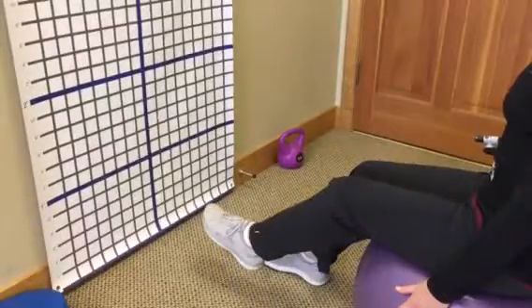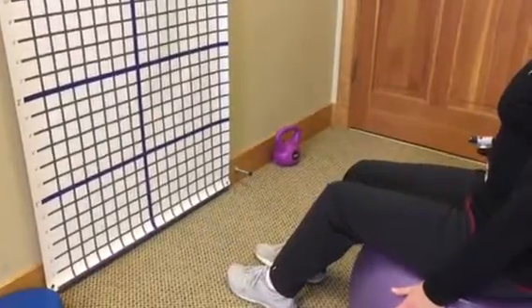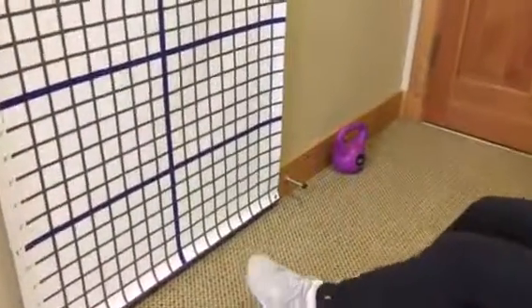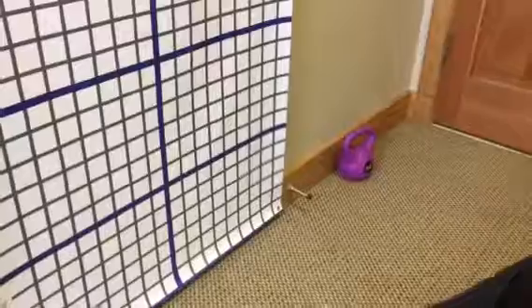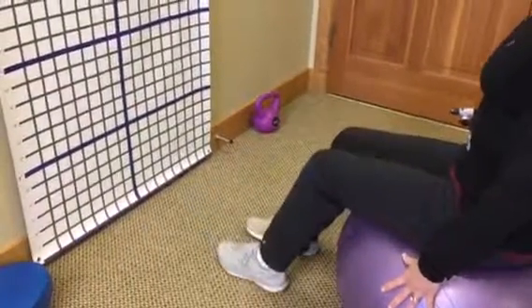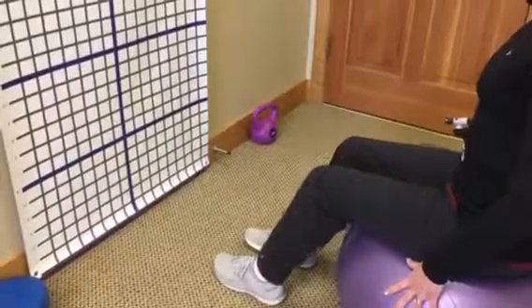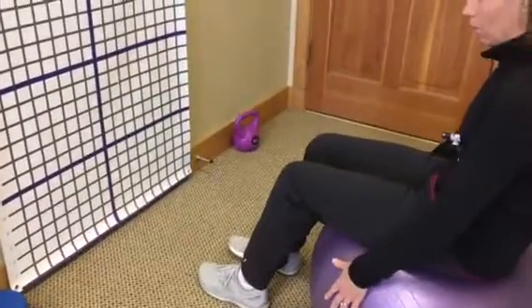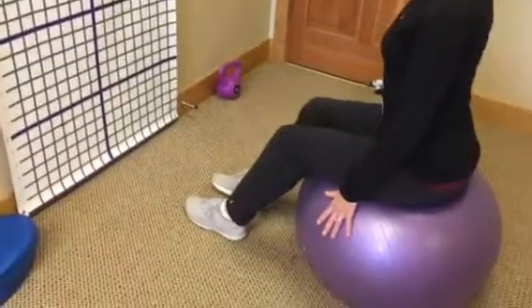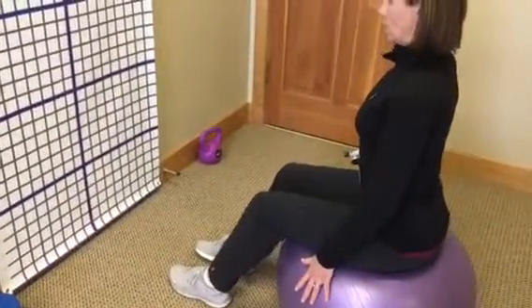Now if I didn't have good stabilization in my core, what might happen is I would start to lose my form and then the patient would be able to see that the laser is going all over the place instead of staying steady. It also cues them to sit up nice and tall. So if I'm rounding forward or extending too much, it's not going to be in the right square.